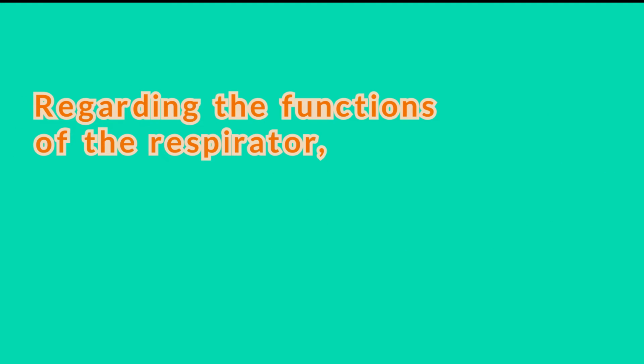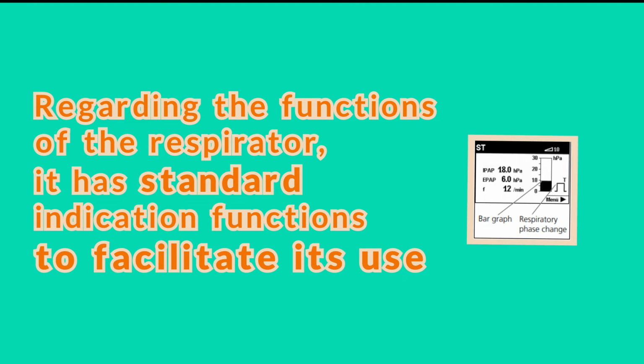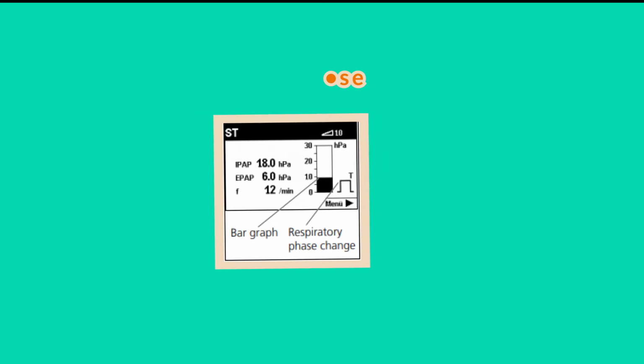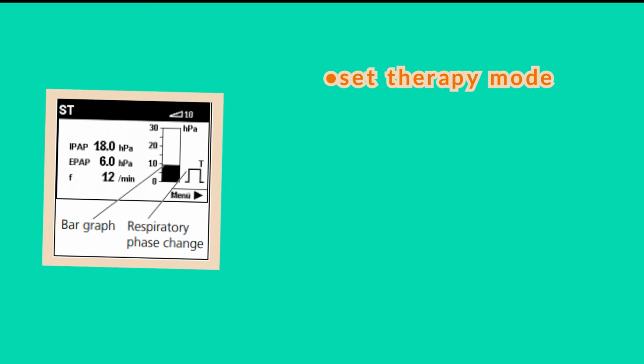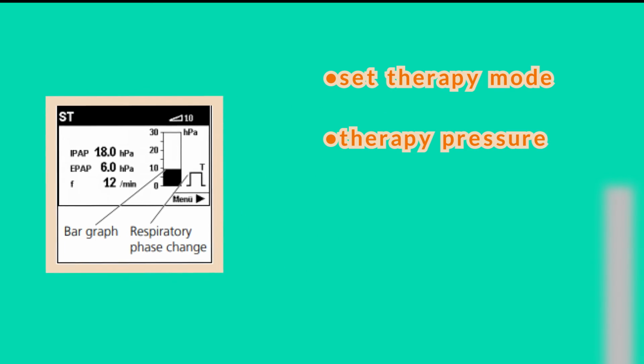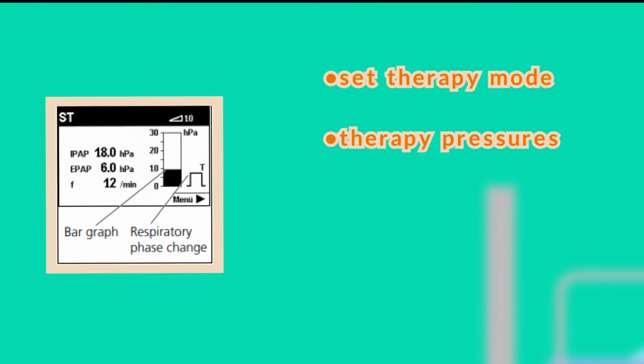Regarding the functions of the respirator, it has standard indication functions to facilitate its use. Next, we will show you the following parameters. Set therapy mode: T, TA, ST, CPAP. Therapy pressures, IPAP and EPAP in hPa, only CPAP pressure in CPAP mode.